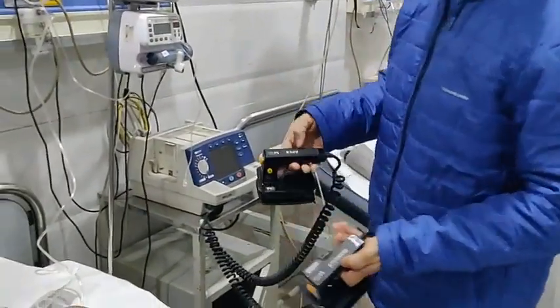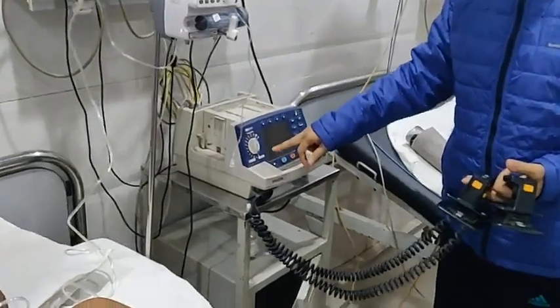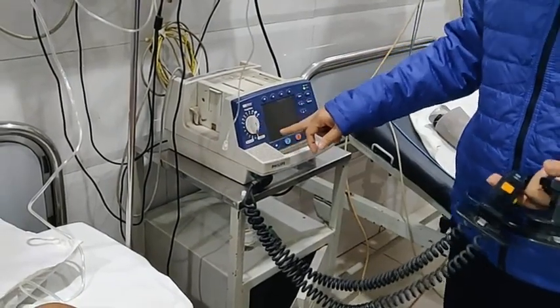This is the sternum paddle and this is the apex paddle. You can see there are different joule settings of energy with which we can deliver the shock.